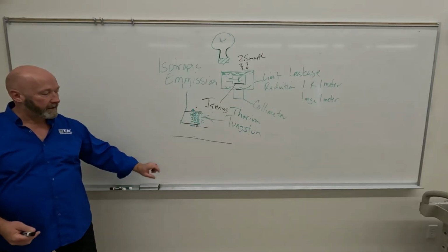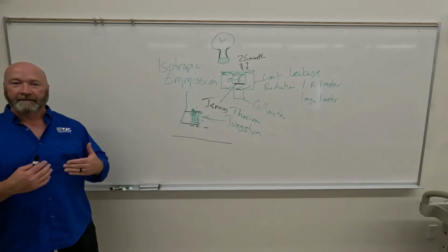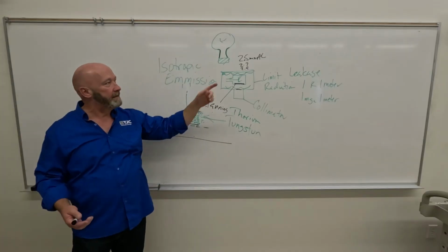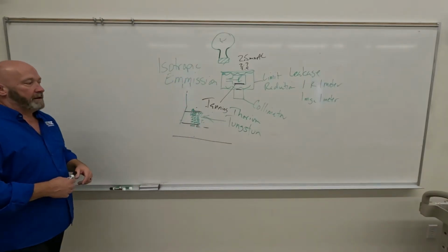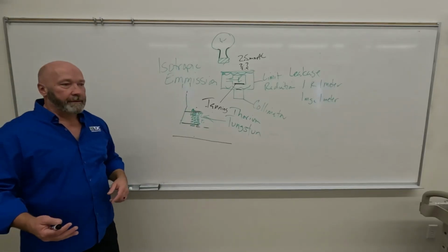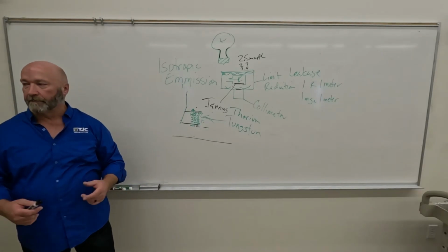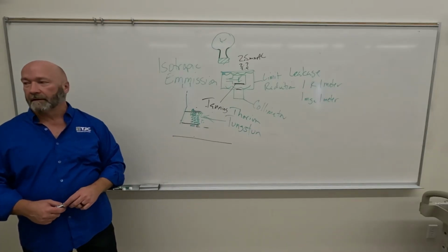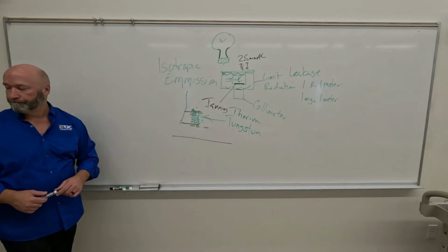If you put a thick layer, maybe, but with a thin layer, even when you unscrew your light bulb, most of the time you can still see through that, even though it's dark, right? So the benefit of the metal envelope is that it doesn't have a problem with arcing. Are we still going to have tanning? Yes, absolutely. But are we going to have arcing? The answer is no. Okay.